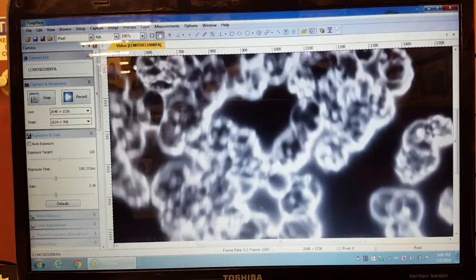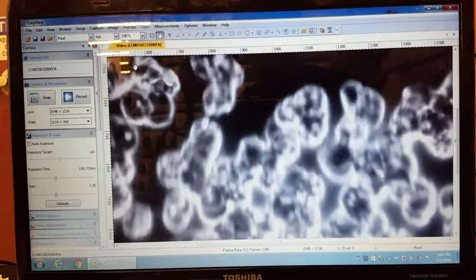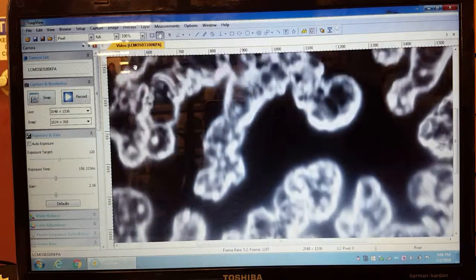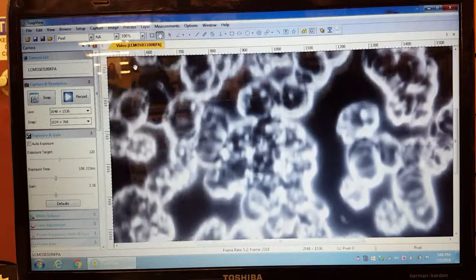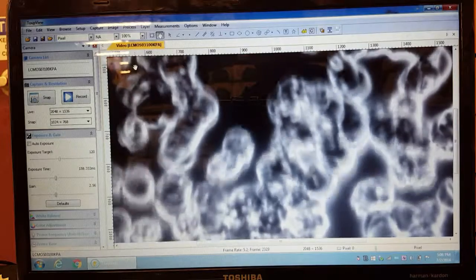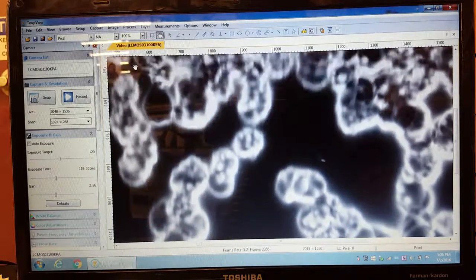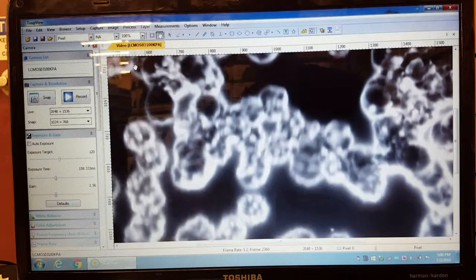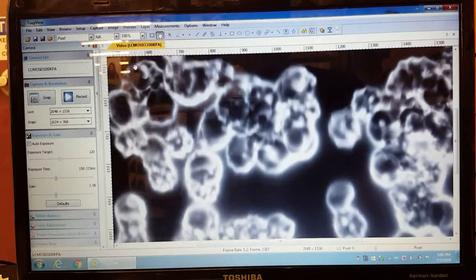I see a tiny little bit of lipids. What did you have for lunch today? I had some beef, some hamburger. Okay, so I see a little bit of fats, some lipid fats in your system. And if I didn't know that, I could have thought maybe you had a little candida, but nope, a little bit of lipids, but not bad. I don't see any candida, so that's cool. I don't see any fungus or any bacteria floating around at this time.